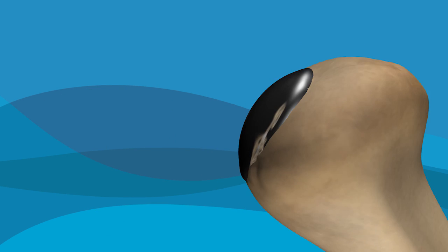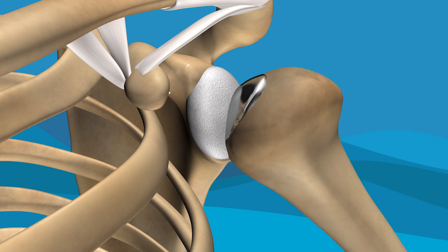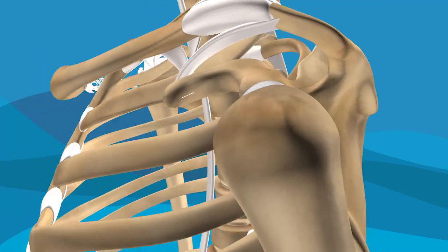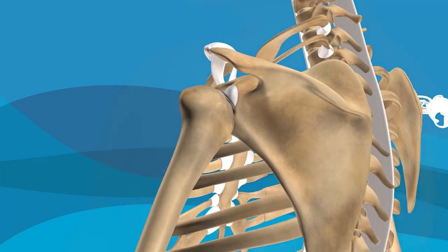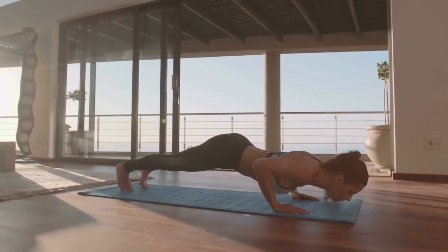With the procedure completed, the two sides of the joint will once again move smoothly against one another, simulating the movement of your pre-injured shoulder. This minimally invasive procedure restores mobility, can be performed as an outpatient procedure, and can allow you to get back to and enjoy an active lifestyle.